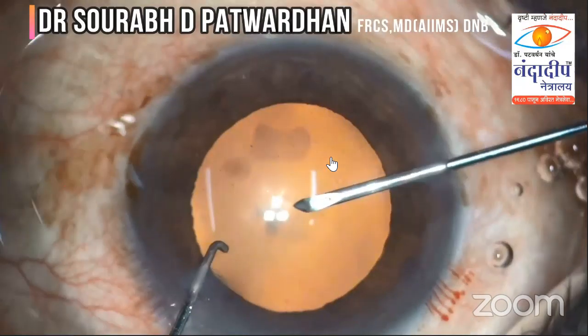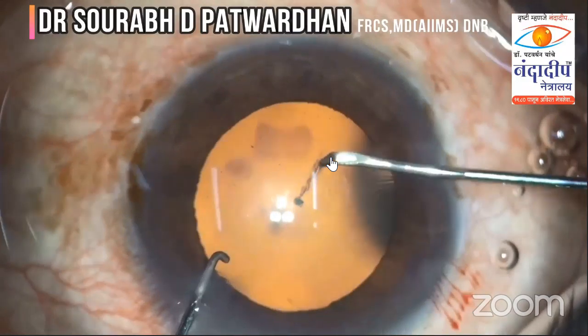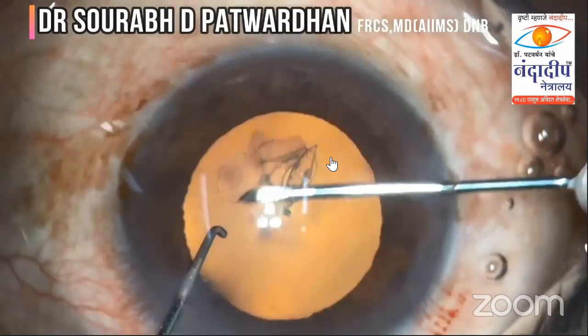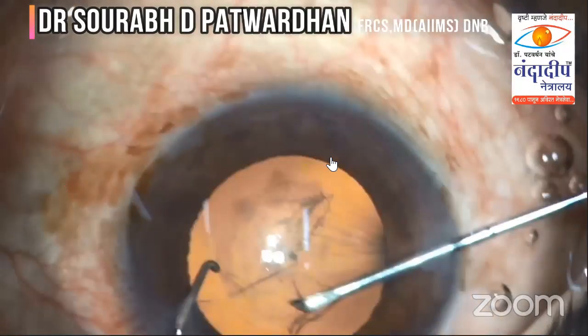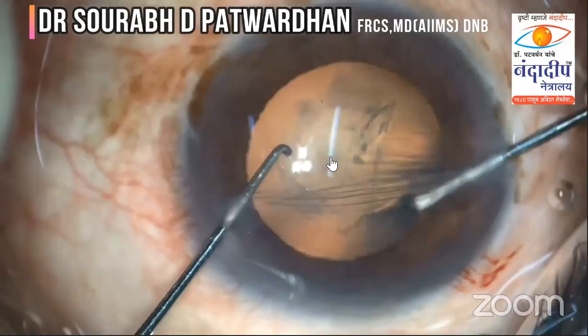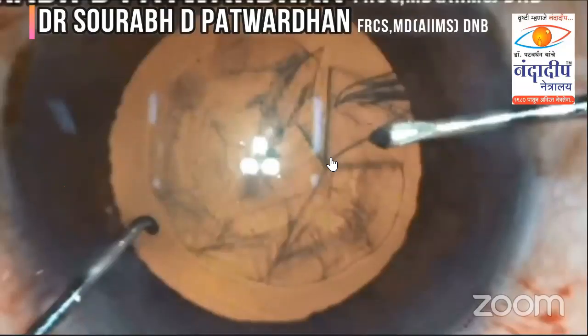So I go from the side port here, start making a tear right from the center, make a radial tear around 2 millimeters, and then I lift up the flap. Again, observe that I am following the rule of center of triangle in how I am forwarding the CCC. Very gradually, as I come into the subincisional area, that is a crucial area. Again, the same rules apply, as you can see here. Hold it at the center of the triangle, not far away, not too close to the CCC edge, and then continue with the tangential movement of the cystitome.